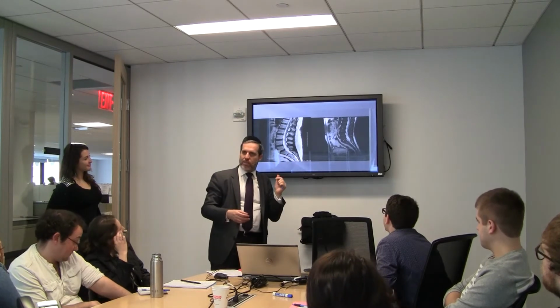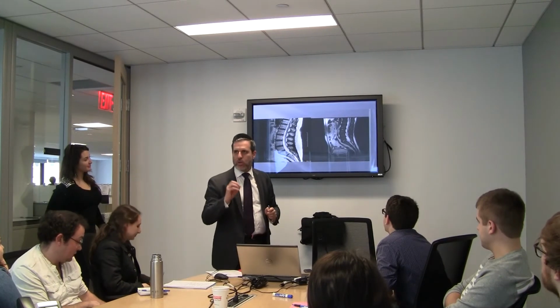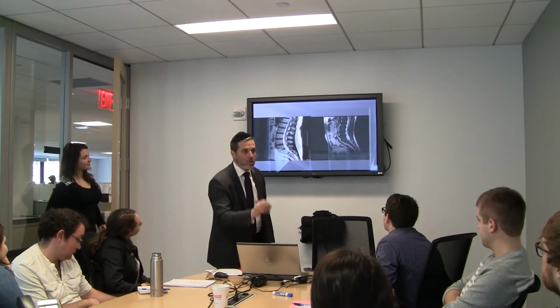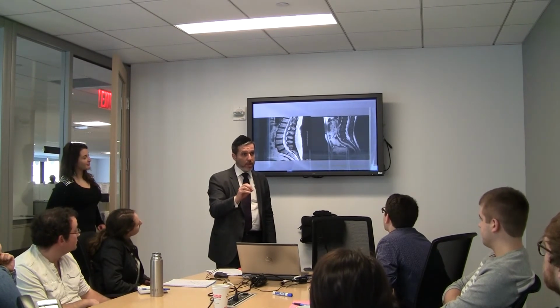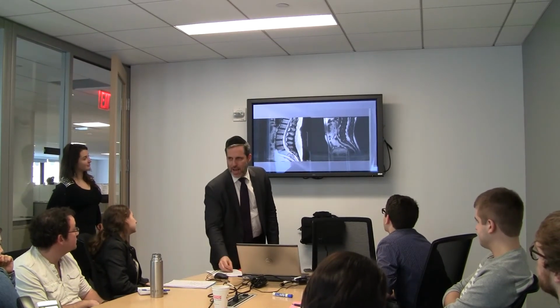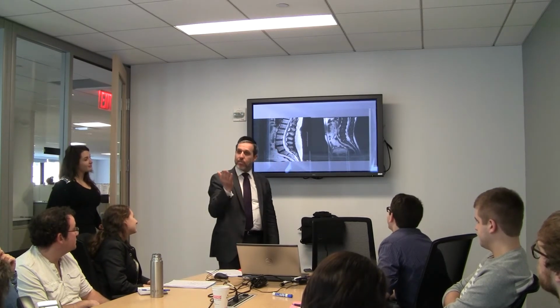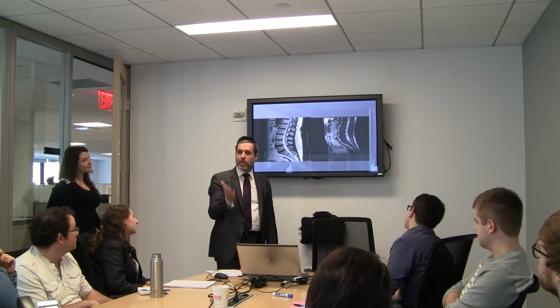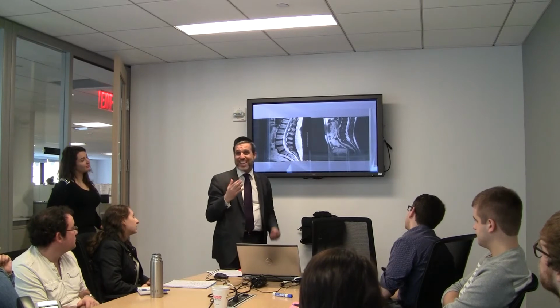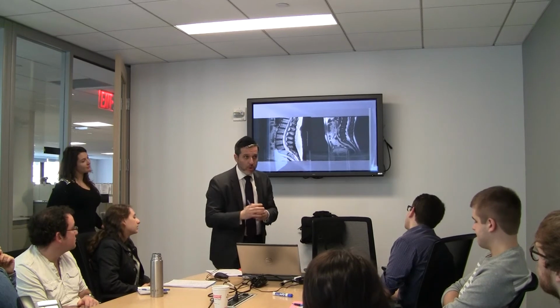And that quality of the image, typically, there are other things, but I just want to leave you with the following. The quality of that image is usually a function of the size of the magnet, the Tesla unit, right? Nikola Tesla. Typical standard, gold standard is 1.5. The Super Daddy Rolls Royce is the 3.0. But also, you can get very good images nowadays just by beefing up the software and the programming. So there's some 1.2, 1.3, or 1.5 units that come close to those higher end 3 units just by beefing up the programming and the software.